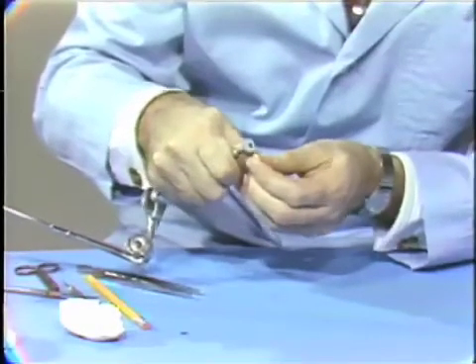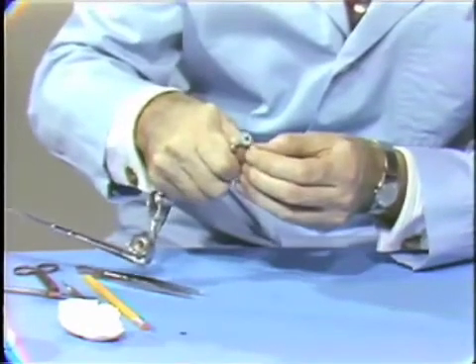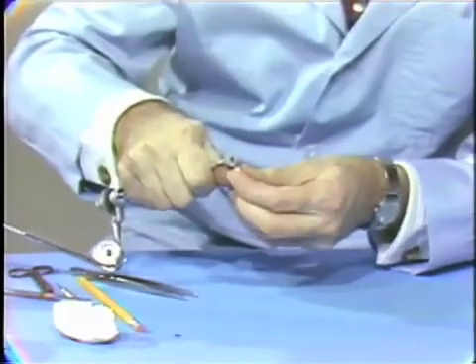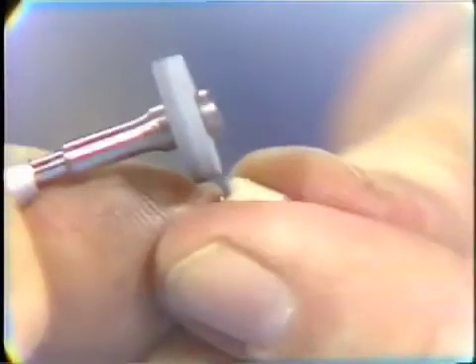Taking care not to touch the porcelain or change the contour of that area. The heatless stone can also be used to go around the periphery in any areas where it's not completely adapted, perhaps in the areas of those bevels where it's not cut back far enough.